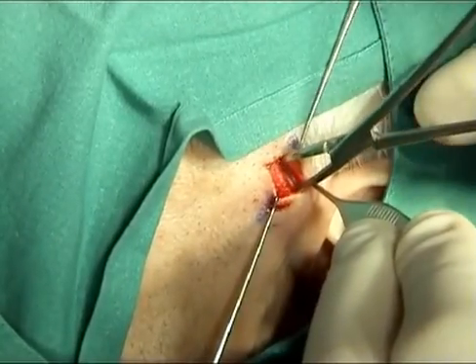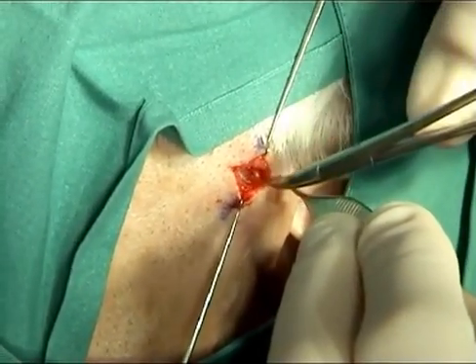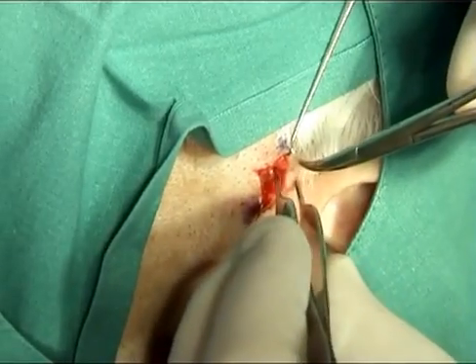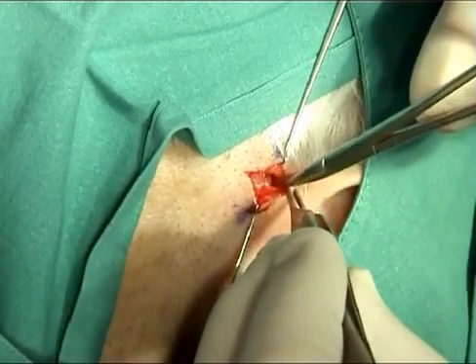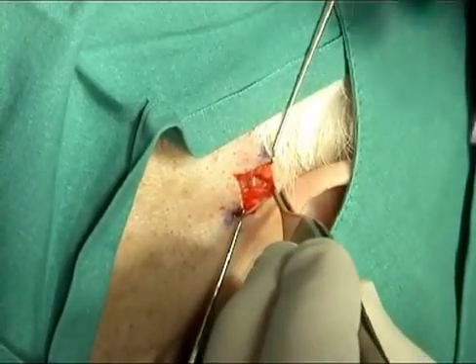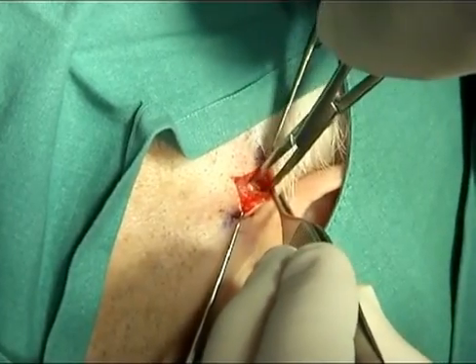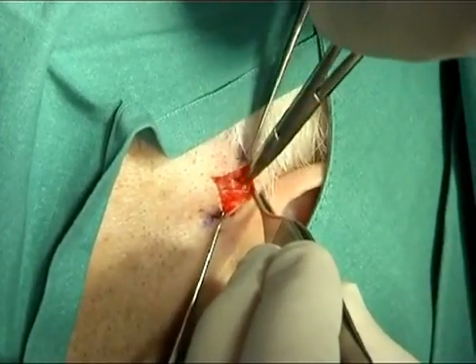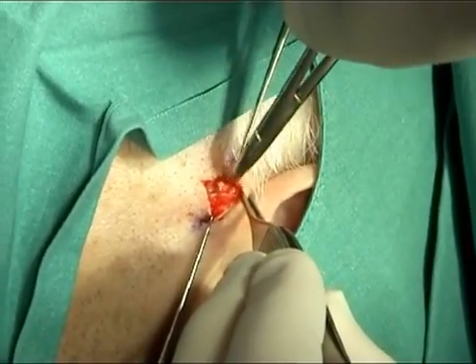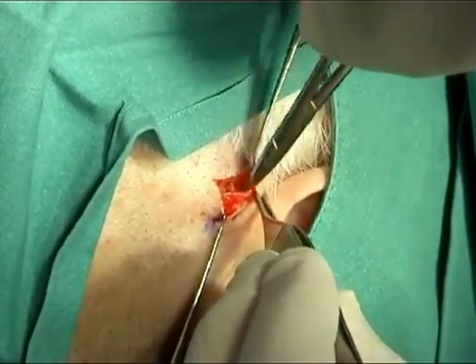The subcutaneous space is developed. The artery is relatively deep and needs to be freed from the surrounding fascia. The artery is shaped like a T.